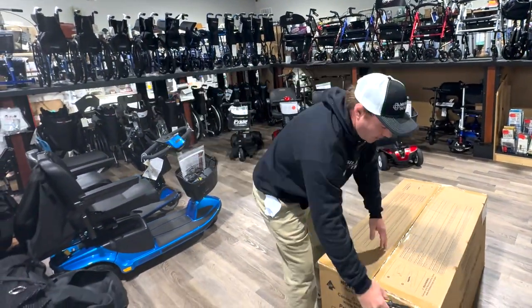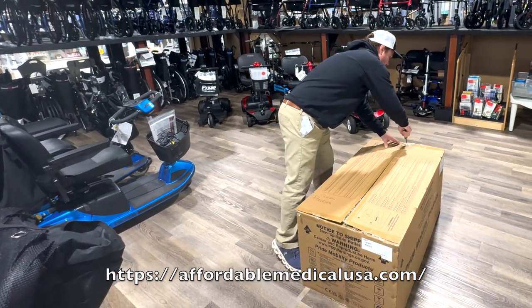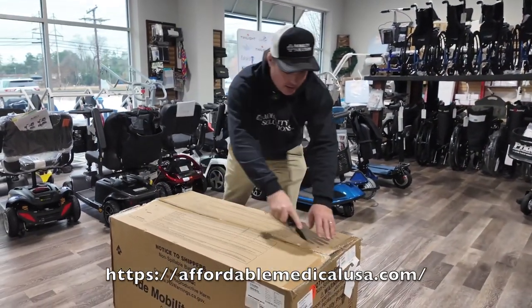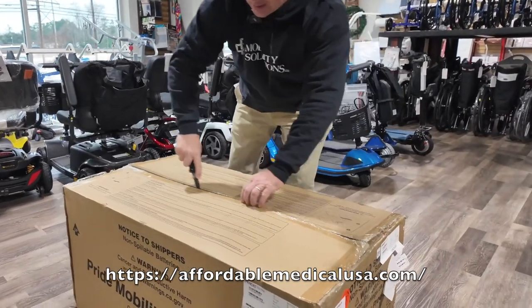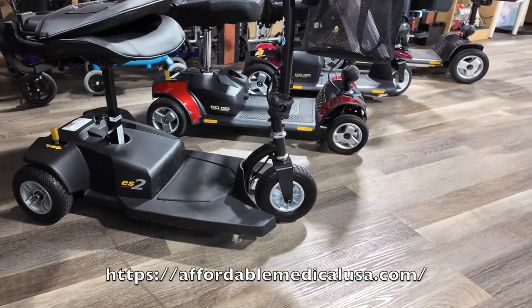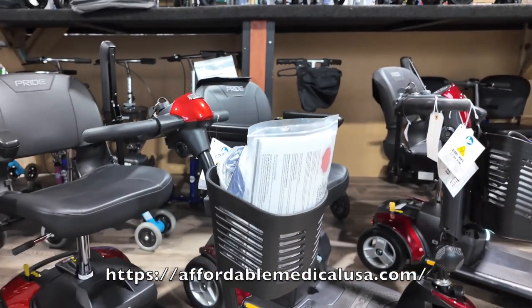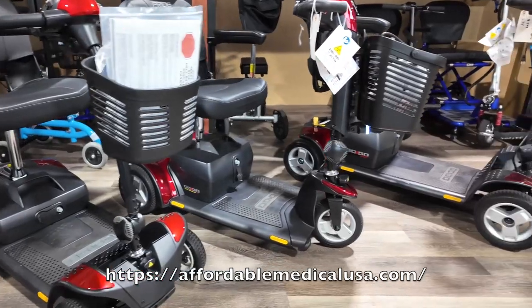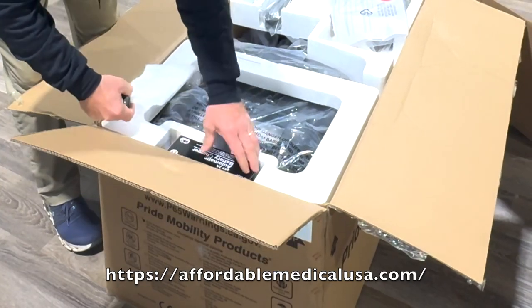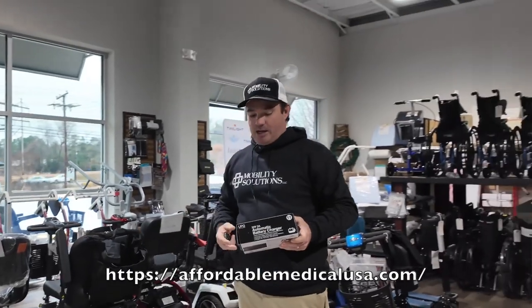Let's go ahead and open this box so you can see what it looks like inside. Pride Mobility makes a bunch of different scooters, and their GOGOs are their most travel-friendly scooters. There's a bunch of different GOGOs: you have the GOGO ES, which is the least expensive, the GOGO Ultra X in three-wheel and four-wheel, and then this one — the GOGO Elite Traveler with standard batteries. You can also upgrade to an HD battery for a little more range.